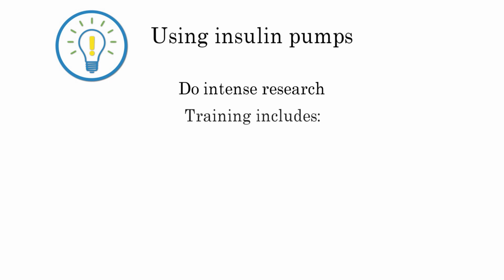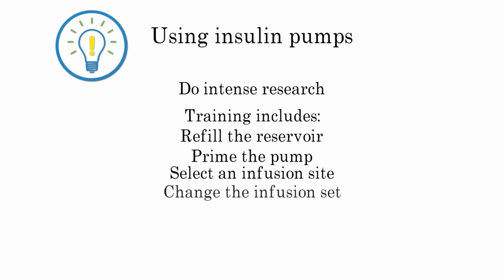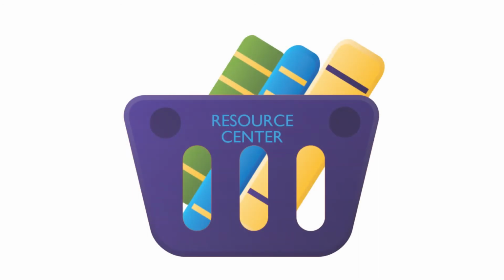To use an insulin pump, it is imperative to get hands-on training from your doctor or diabetes care team. You will learn how to refill the reservoir, prime the pump, select an infusion site, change the infusion set, calculate basal rates, troubleshoot, and create backup plans should the pump fail.